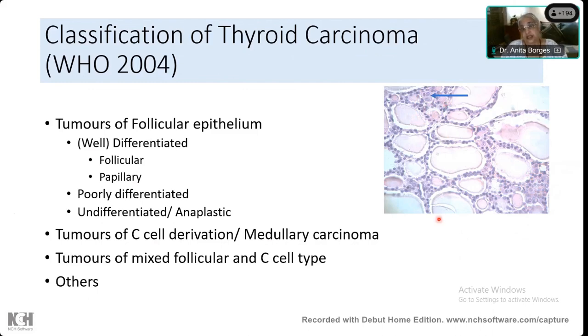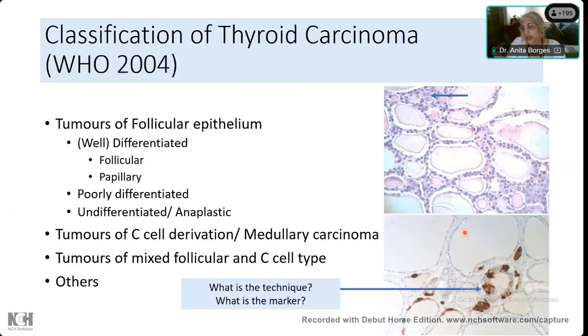C cells I have shown over here where the arrow is. Okay, and if you really want to show C cells, then you have to use a special technique.